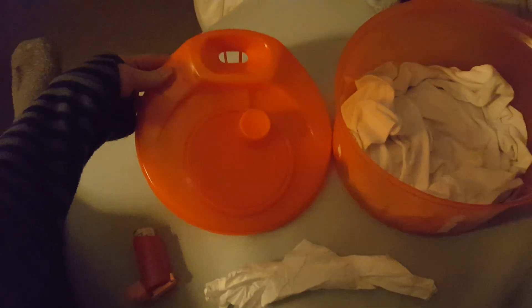Here I have a salad spinner that has the perfect little hole in the top. I took the screen out and then I put a t-shirt — a dirty t-shirt of mine — in there, or something thin, a tissue, because the tissue is going to be used to fill around the hole of the salad spinner.